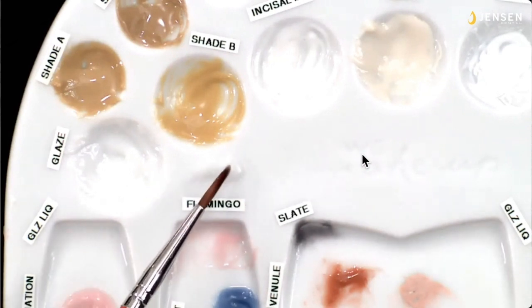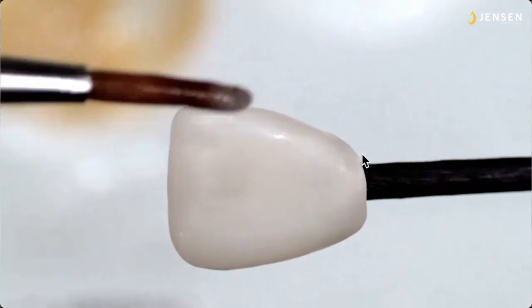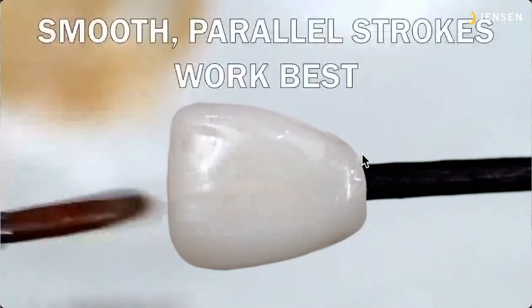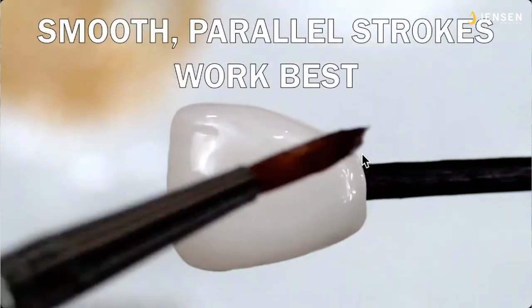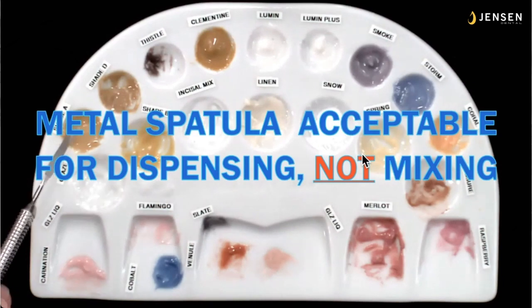So I get just a little bit of my InSync paste glaze liquid, and I just pat it down, just enough to get it to flow. If it's too thick, like you saw in the last video, it goes on kind of like sour cream, but we want to have just a smooth, even coat. Think of this like somebody's having nail polish put on. So just a gentle, even coat. It shouldn't take you more than about 6 seconds to cover a tooth.